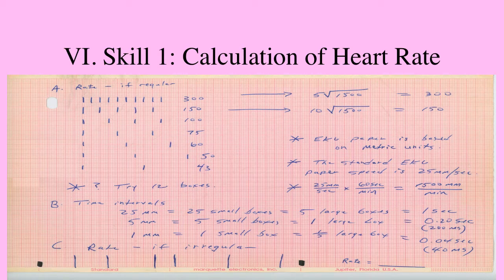If we go forward to the next slide, I want to work on skill 1, which is a skill that you've used in courses in this curriculum, where we are trying to determine heart rate. You can do that by palpating the pulse in different areas of the body, often at the wrist, the radial pulse. You've probably had a lot of experience doing that. We also can figure out the heart rate by the EKG, so we'll go through that technique here.